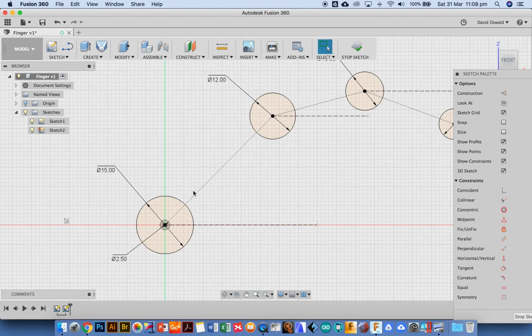I'm going to zoom in on just these two circles to start with. And I'm going to hit Line Tool. And I'm just going to draw a line somewhere between, it's locked on with a little X, between that line and that circle. Make sure it's locked, it's not sitting out in the open here somewhere. Not worry about the length. Do the same thing here to here.